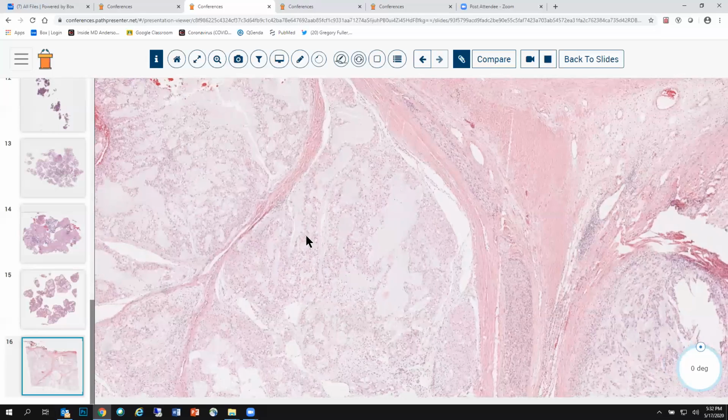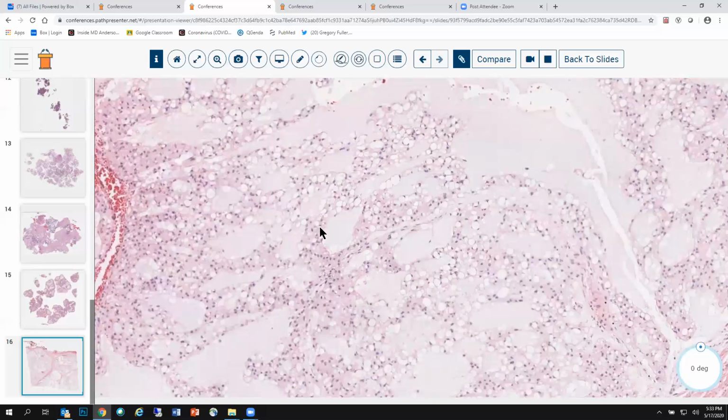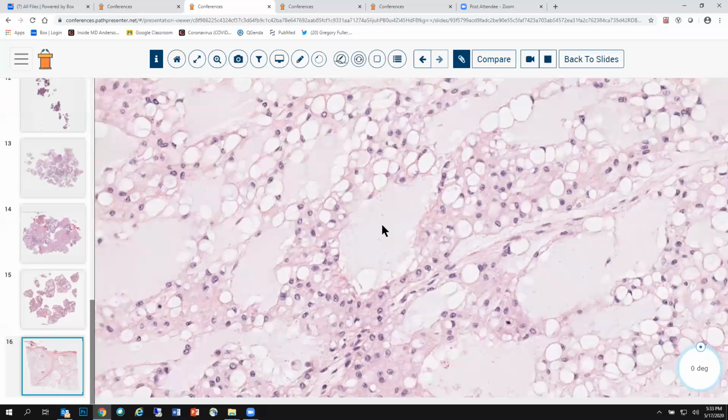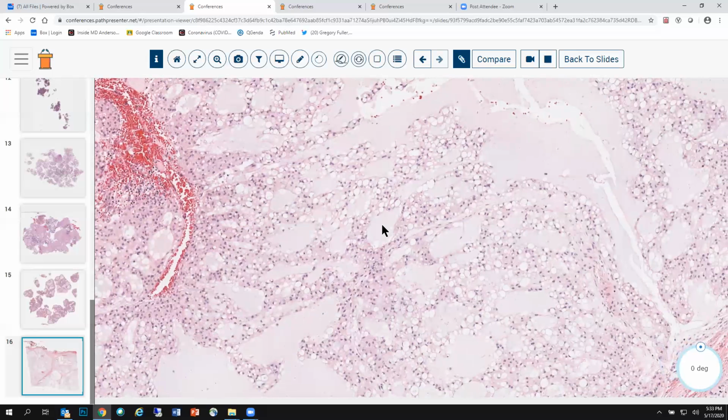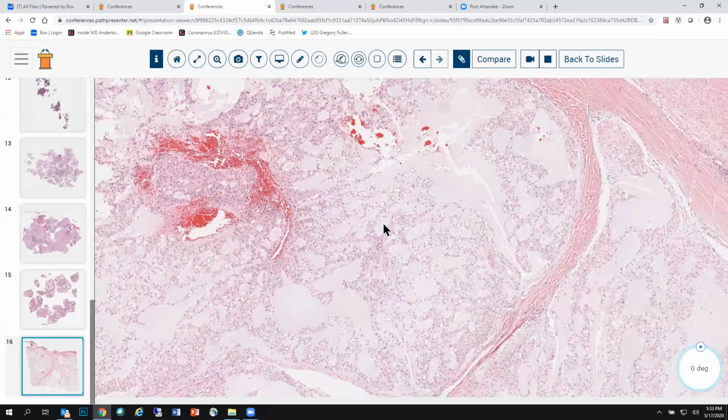How would you prove it's chordoma? Well, you would run immunohistochemical stains. Historically, the three stains that would be run are typically two epithelial stains, pankeratin (a keratin cocktail) and EMA, epithelial membrane antigen, so two different classes of epithelial markers, and a neural crest marker, S100 protein. Classically, chordomas would be positive for all three. Sometimes the S100 can be very iffy. Many times it's only cytoplasmic, not nuclear. Not nuclear, that is fine. It can be the weakest of the three, but in the context, that's diagnostic.